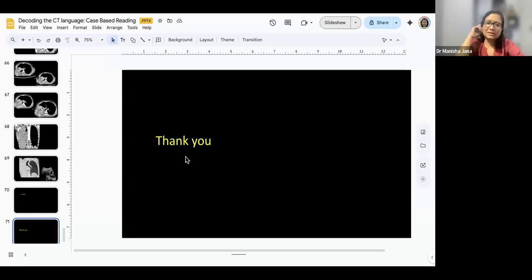Okay, so first thing, mostly except from the very peripheral areas, there is multi-detector CT everywhere in the center. So the slice count of the CT scanner does not really matter beyond about 16 slice. It doesn't matter if you're doing it in a 64 slice scanner or a 256 slice scanner; that is not really going to make a lot of difference in diagnosis.